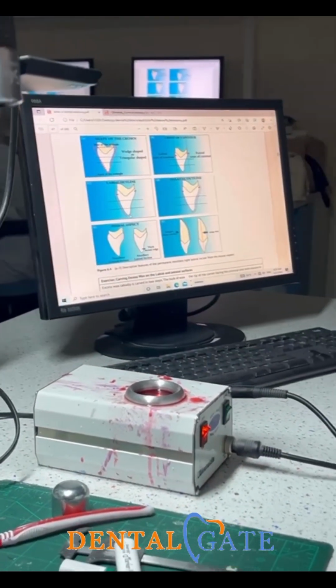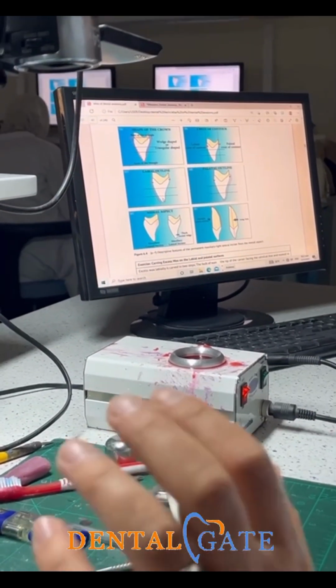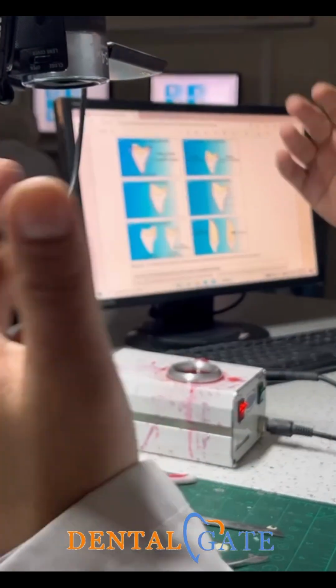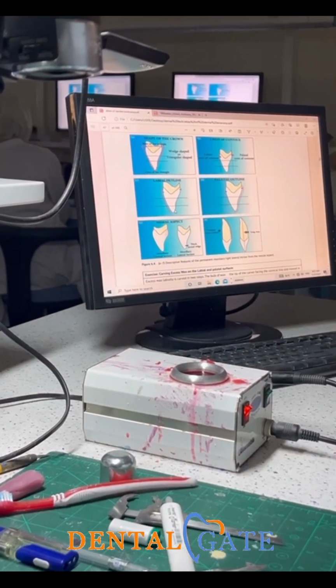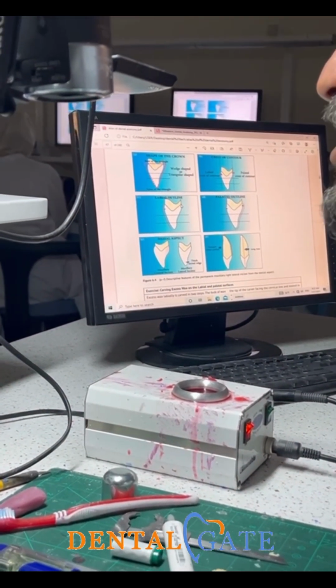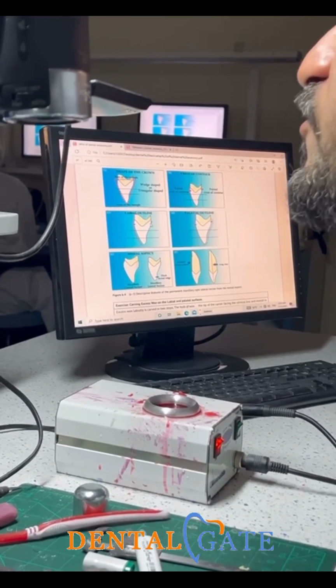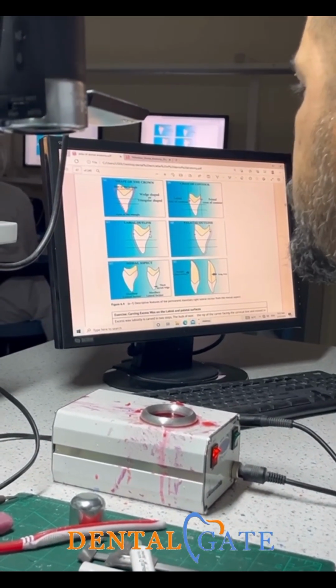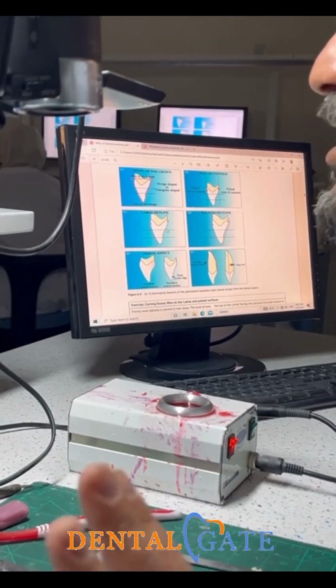This is a rounded tip. I will leave it to the incisor. Don't make it very sharp, please, because we have an incisal edge, okay? So please start from here. Start from the cervical, from the 5 to 6. This is the maximum convexity until we reach a slightly concave area.